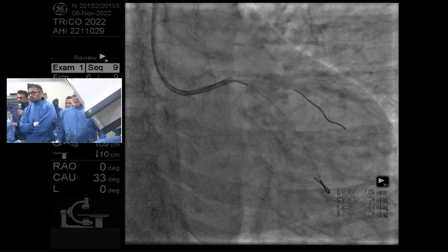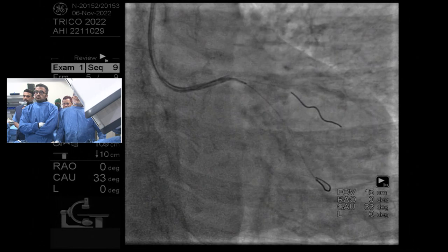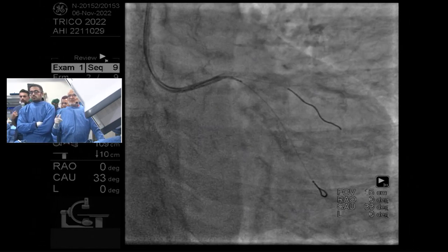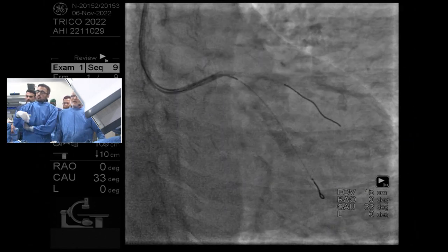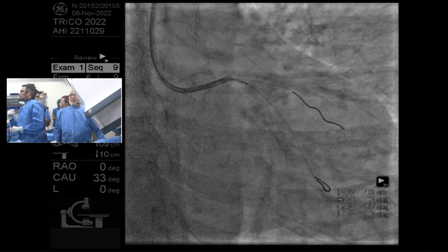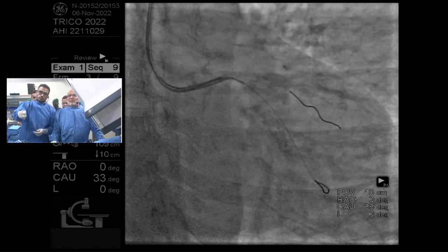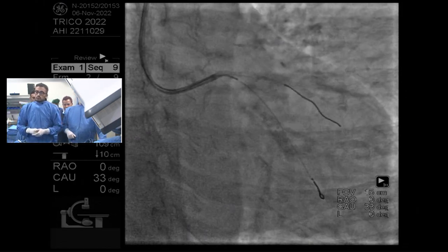Show me the angio. Yeah, the previous angio. Right? So with zero contrast, we systematically end up taking longer stents because we're going largely from normal to normal, and that's what builds in safety into the technique. The idea is to build in safety.